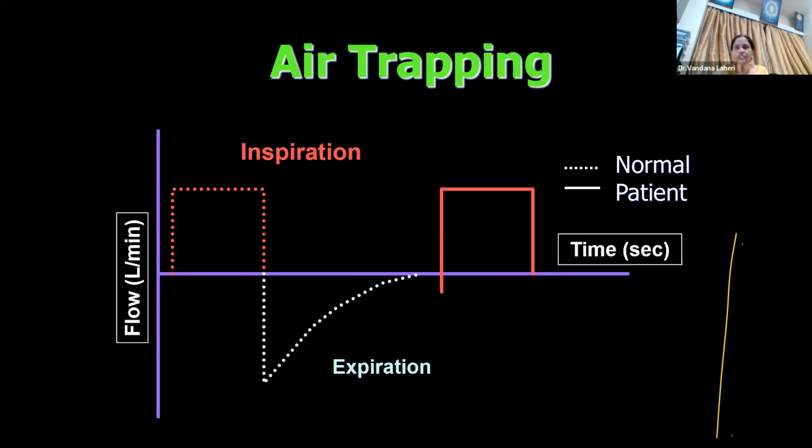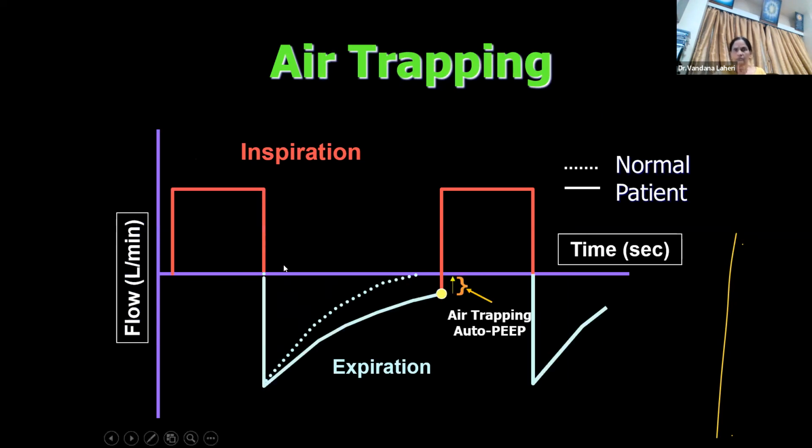Is someone doing something? Because now somebody is putting in apps over here. Air trapping. How can you make out air trapping? Can you see? This is the flow graphic. Okay, inspiration. Who is Dr. Devika and what is he requesting? I just don't know. Can you read this? Dr. Devika is requesting remote control of your screen.